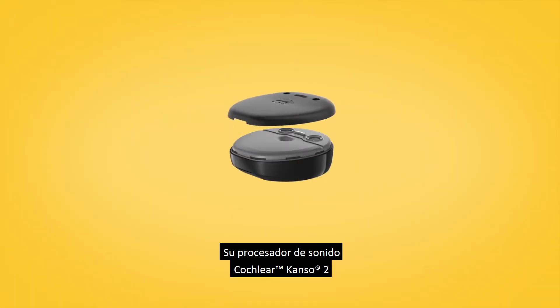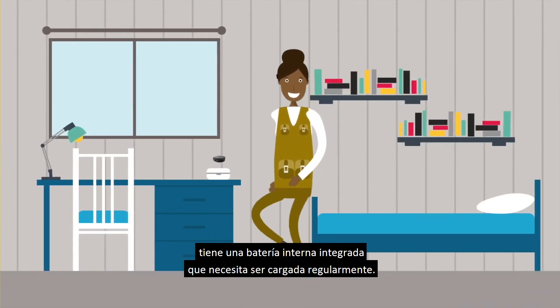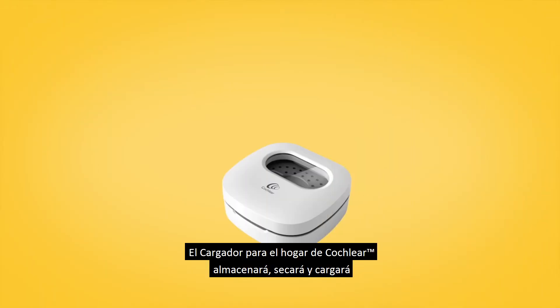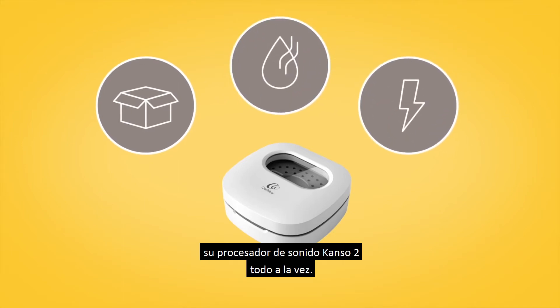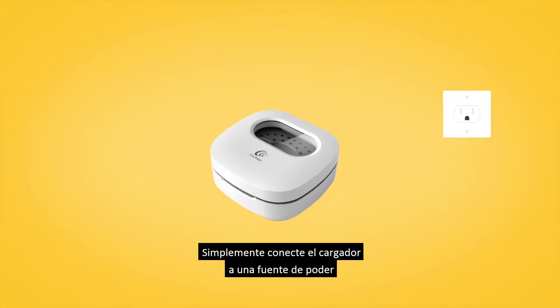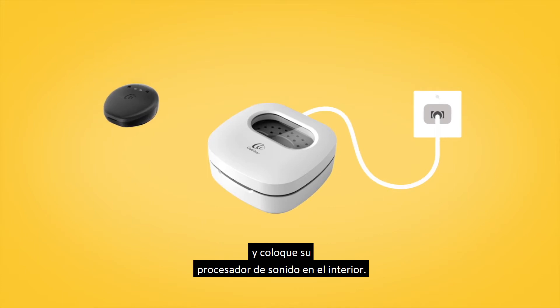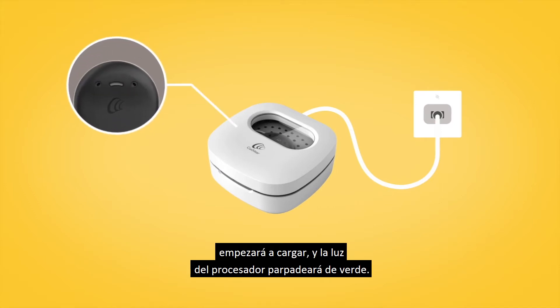Your Cochlear Kanso 2 Sound Processor has an integrated internal battery that needs regular charging. The Cochlear home charger will store, dry, and charge your Kanso 2 Sound Processor at the same time. Simply connect the charger to a power source and place your sound processor inside. When you close the lid, your Kanso 2 Sound Processor will begin charging and the processor light will flash green.